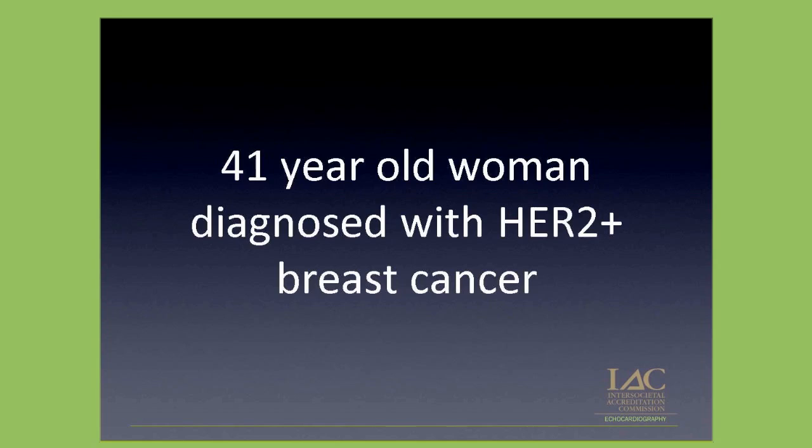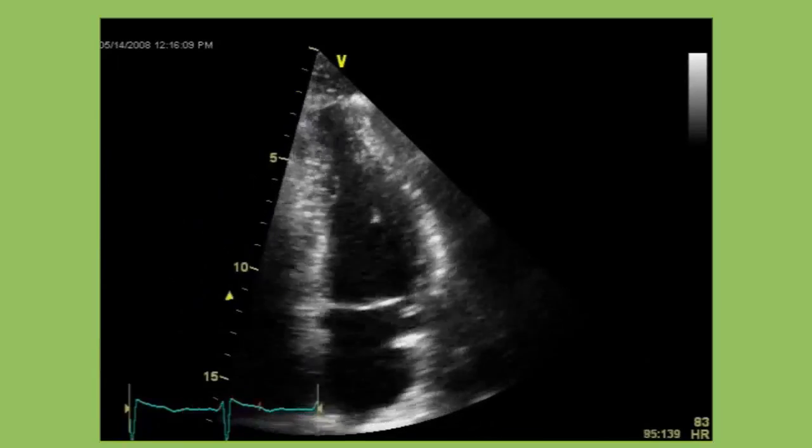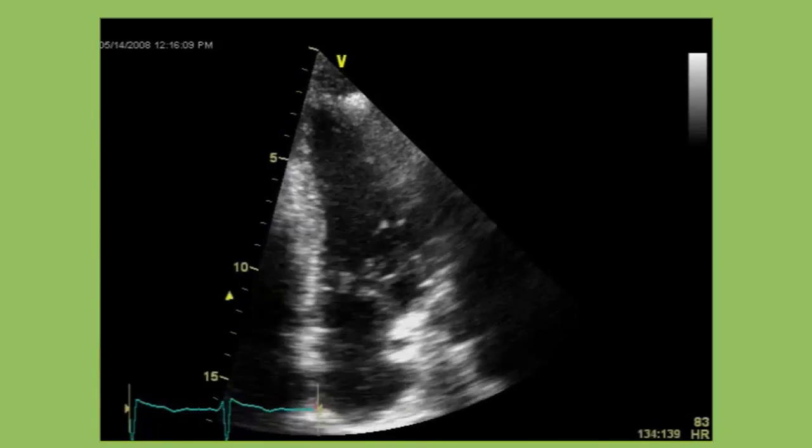For all of the sonographers that we have online, I want you to take a look at the 2 images and answer one simple question: whether further cardiac workup is needed or not. Let's take a look at the first image. This is an apical 4-chamber view, and then the apical 2-chamber view.